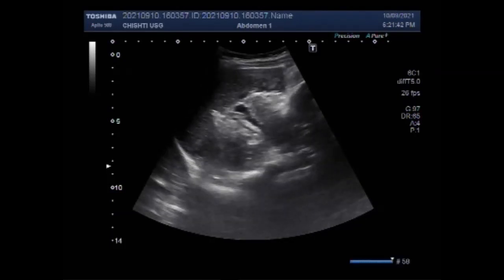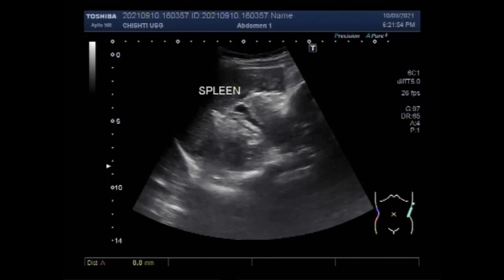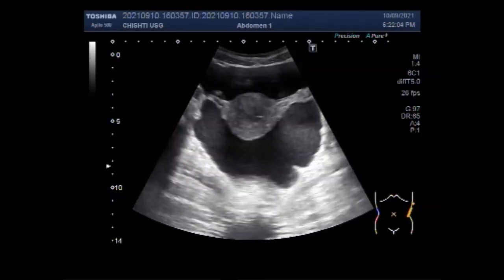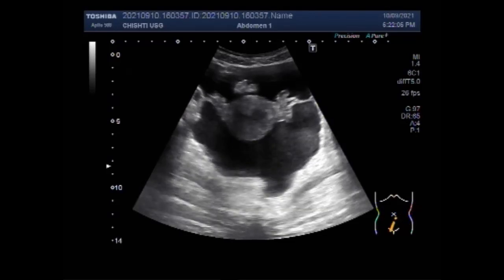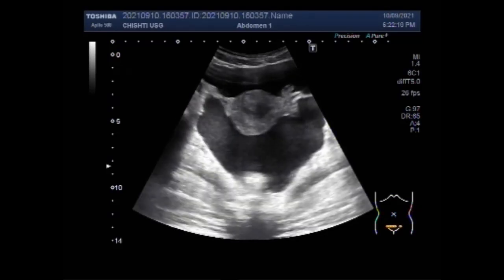Now you can see the liver and spleen are echotexture-normal, normal in size, shape, and echo-texture. So trauma to these two organs is out of question. The source of bleeding must have been within the intestine.